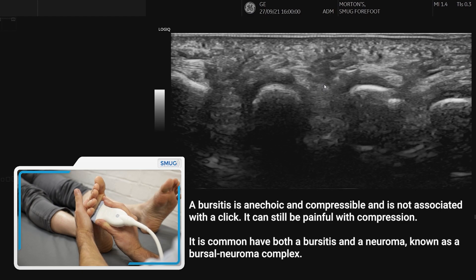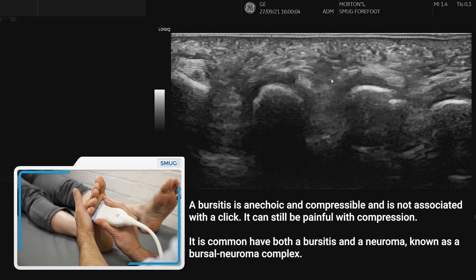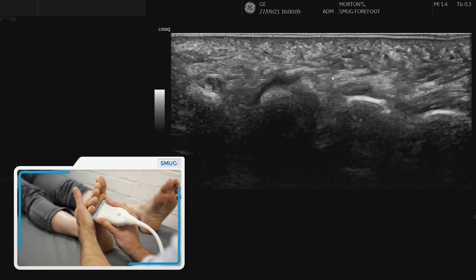If it's anechoic and compressible then that's more likely to be a bursitis, but very commonly they occur together as a bursal neuroma complex.